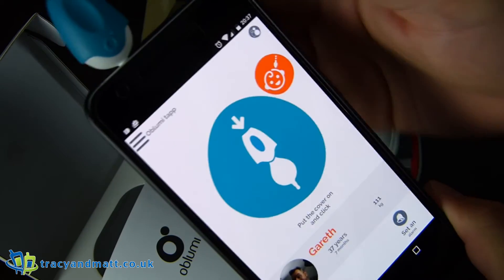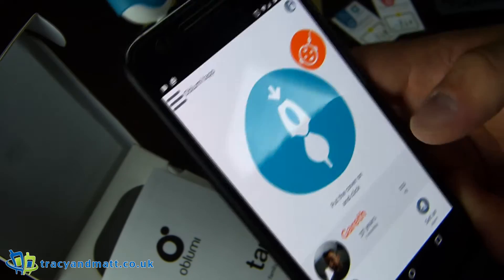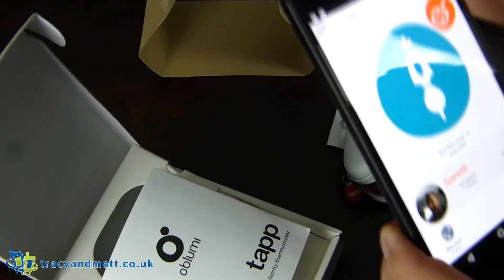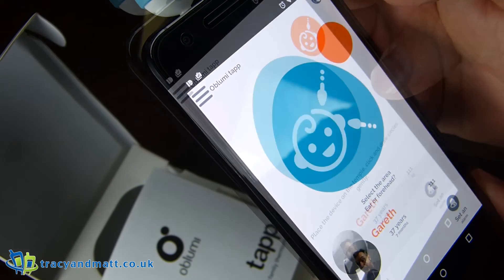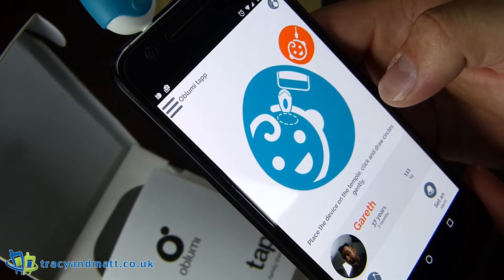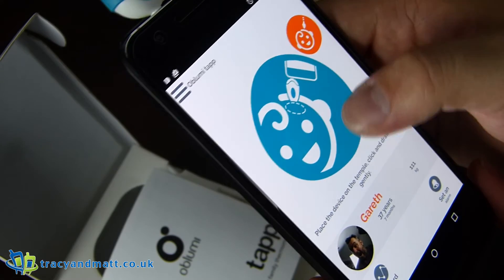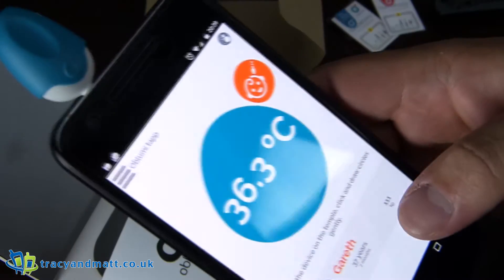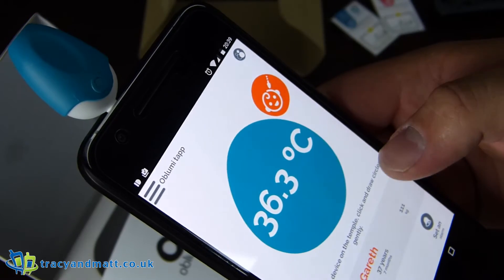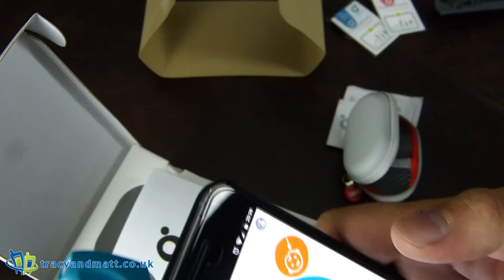Pull the cover — or put the cover on — and click. We're clicked. Place the device on the temple, click, and draw circles gently. And my temperature is 36.3 degrees, hopefully. I don't have another thermometer to be able to test that.